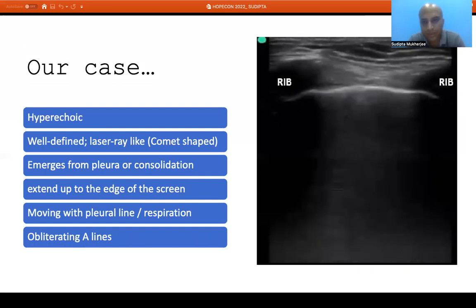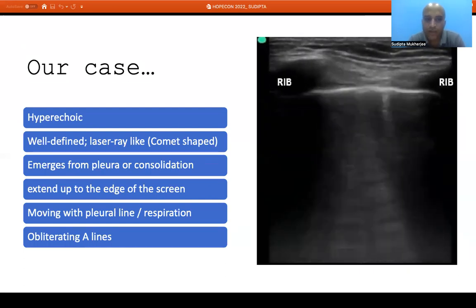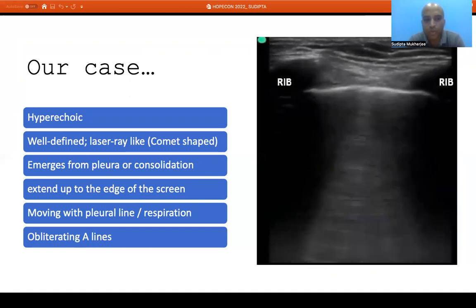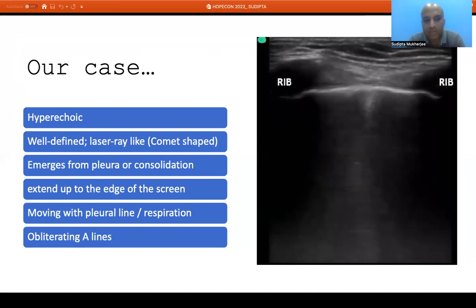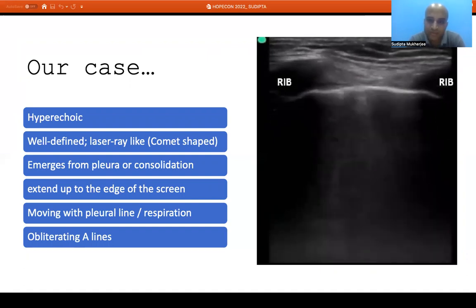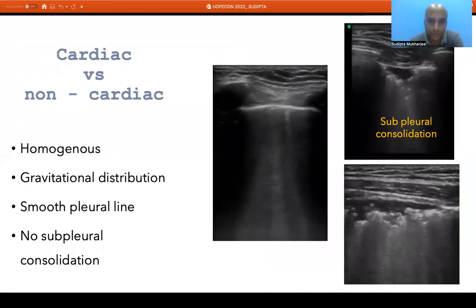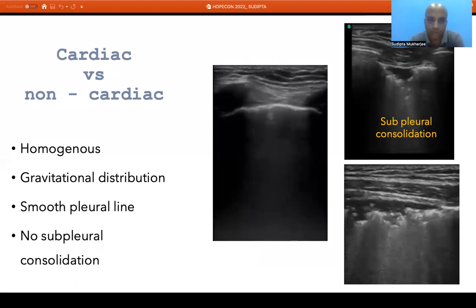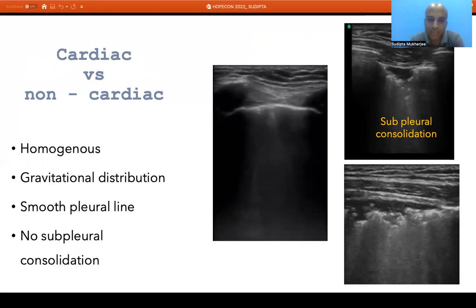In our patient, however, we see hyperechoic, well-defined, laser-like ray-shaped structures — also called comet-tail artifacts — emerging from the pleural line, moving with respiration, and obliterating the A lines. These are called B lines. B lines indicate deaeration of lung under the probe, meaning there is less air — possibly due to increased fluid, thickening of the interstitial membrane, or another cause. Because there is more tissue or fluid, ultrasound beams can now pass through the lung tissue. We then need to determine whether this deaeration is from a cardiac or non-cardiac cause.